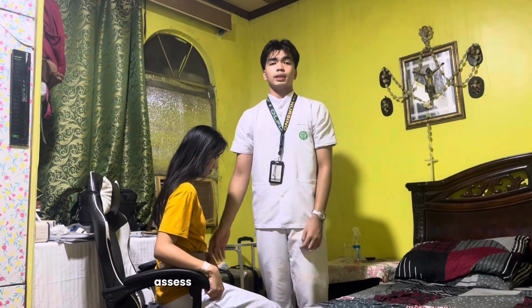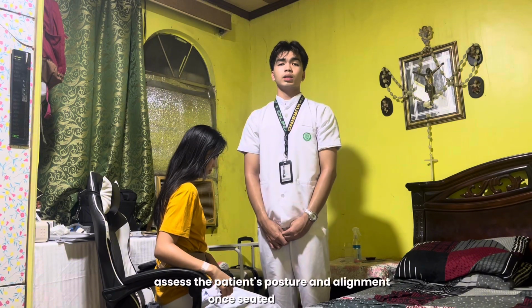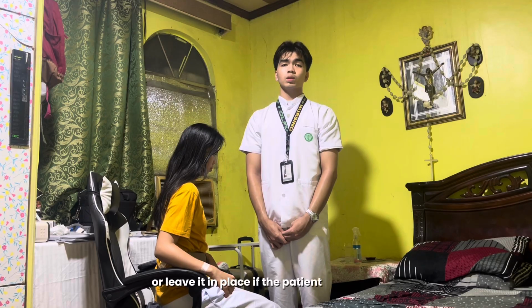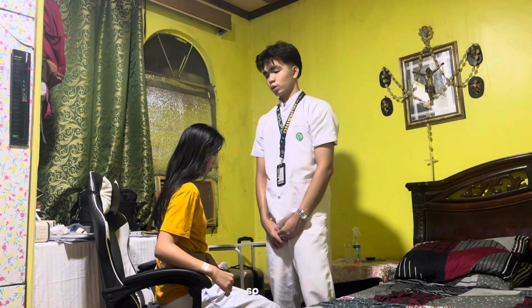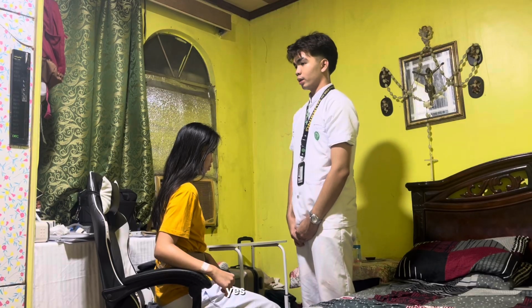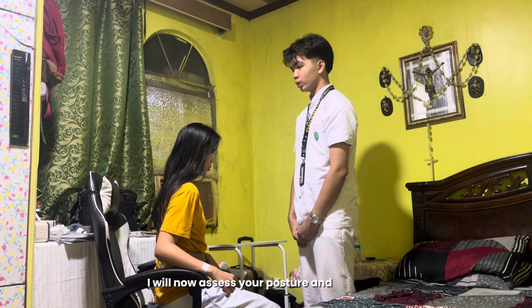Then after that, assess the patient's posture and alignment once seated in the chair. Then remove the gait belt if desired or leave it in place if the patient will return to bed soon. So ma'am, are you comfortable naman po sa position nyo? Yes. Then I will now assess your posture and remove the gait belt po.